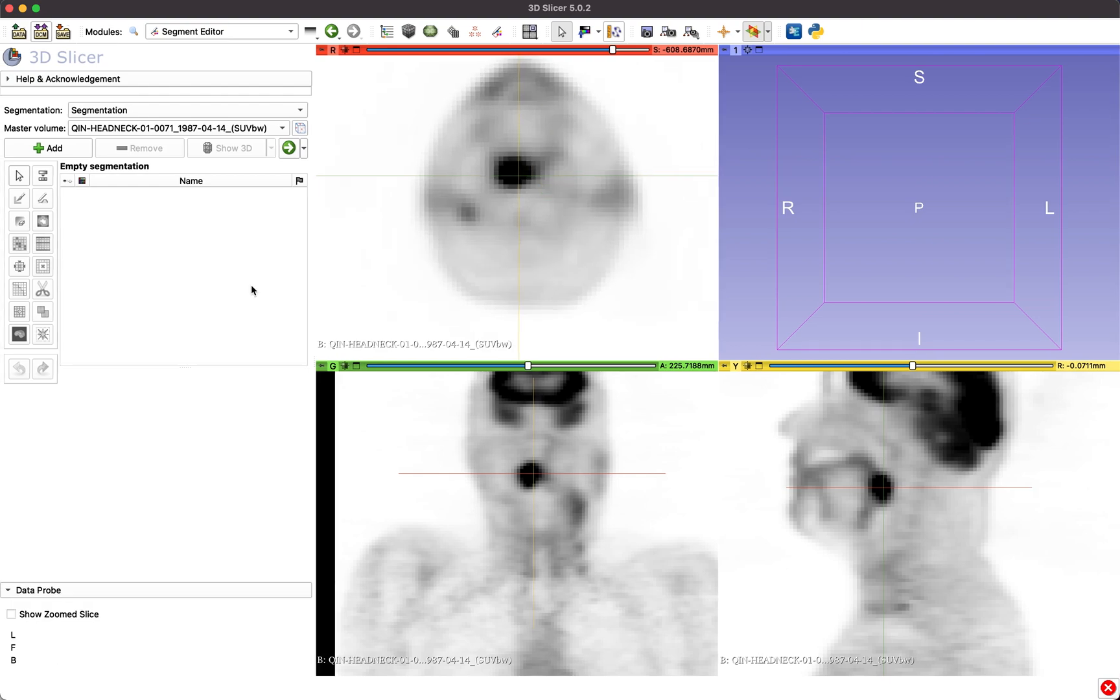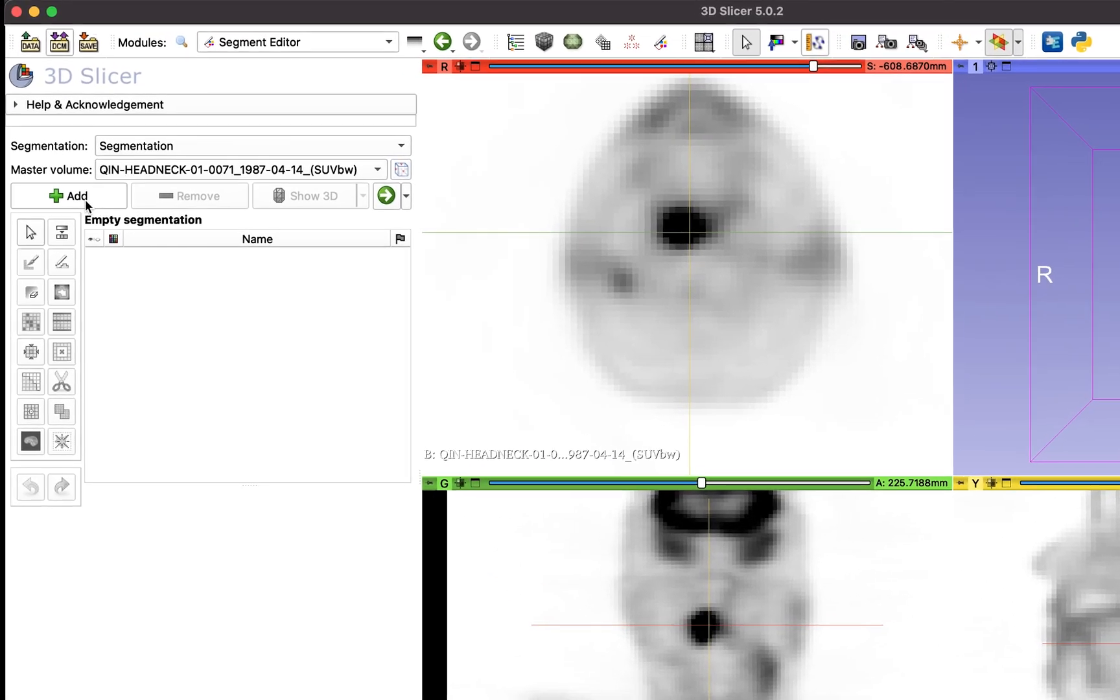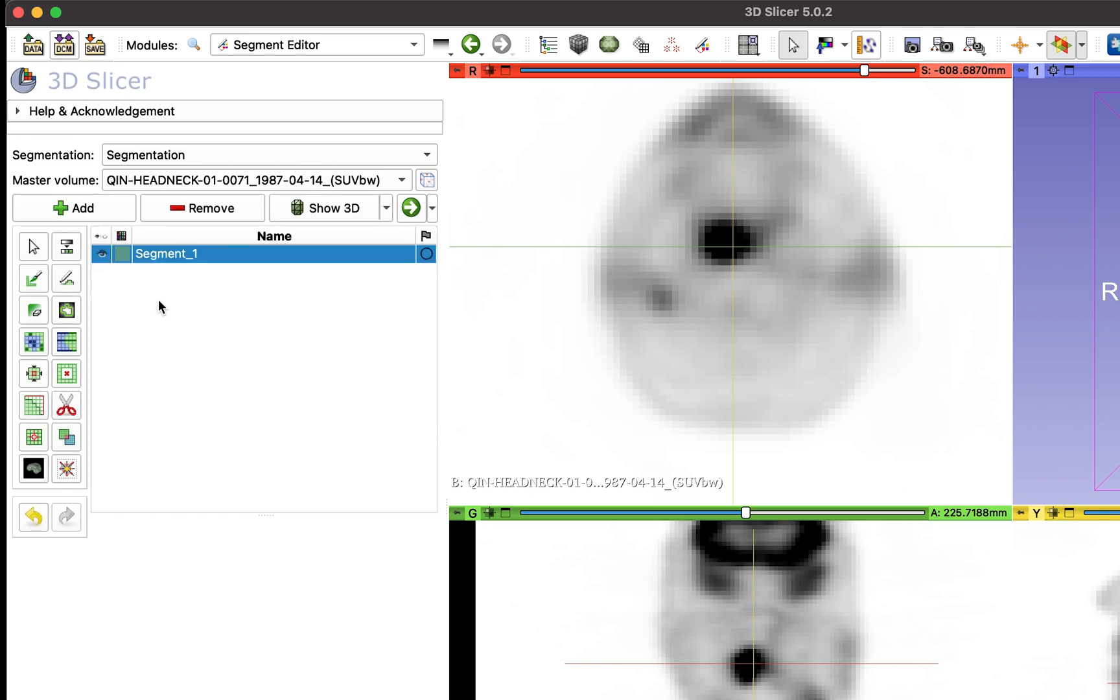Once a lesion has been located, the user can start the segmentation process. Click Add to create a new segment for the lesion, then click on the PET Tumor Segmentation Effect icon.